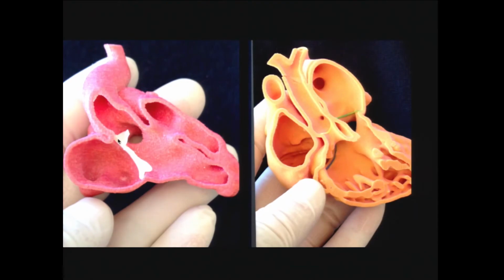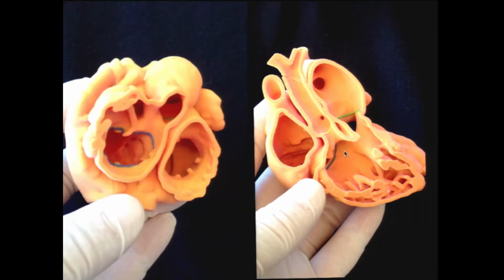So this is the tricuspid valve leaflet, and this is the right ventricle, aortic, and pulmonary outflow tract. The infundibular septum is here, isolating the VSD from the pulmonary valve, so therefore it is a subaortic VSD. Here, the infundibular septum is to the right margin of the VSD, therefore this outlet VSD is below the pulmonary valve. So those are the very classic cases.